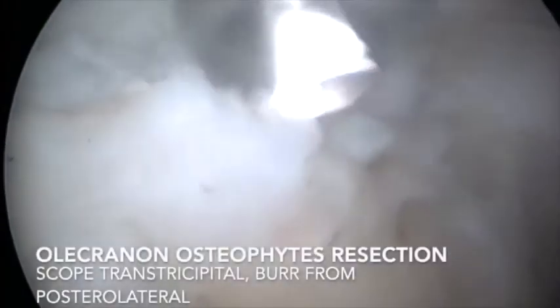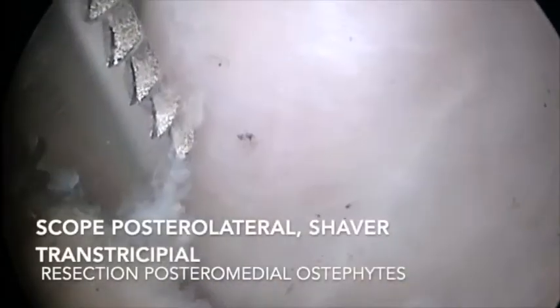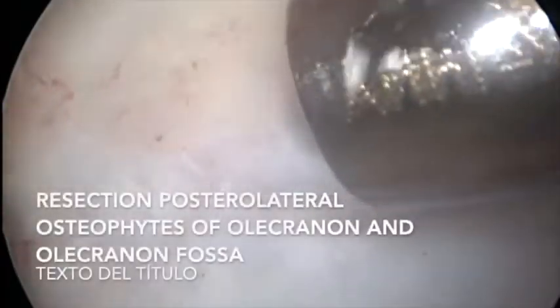Depending on the part of the olecranon that we are going to resect, we place the scope in the transtricipital portal with the burr in the posterolateral portal, or alternatively the scope in the posterolateral portal with the burr in the soft spot or transtricipital portal.